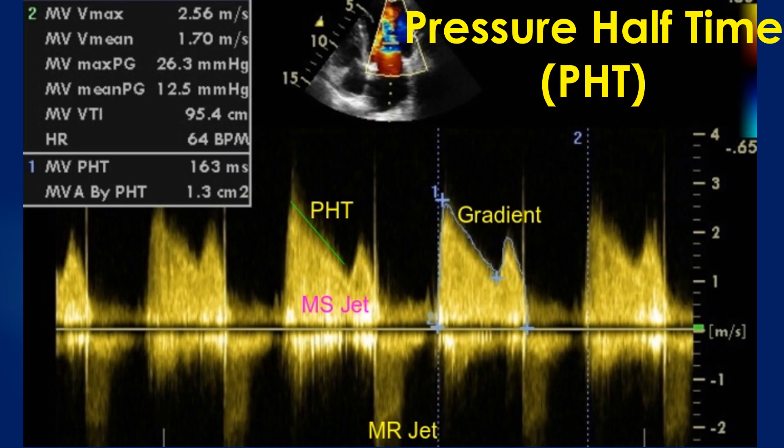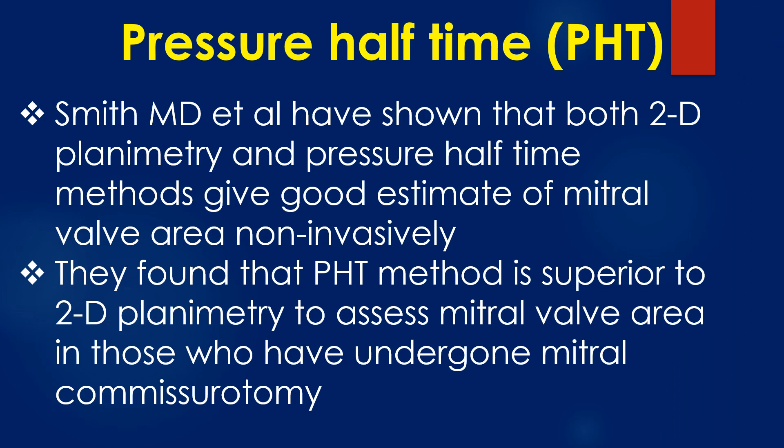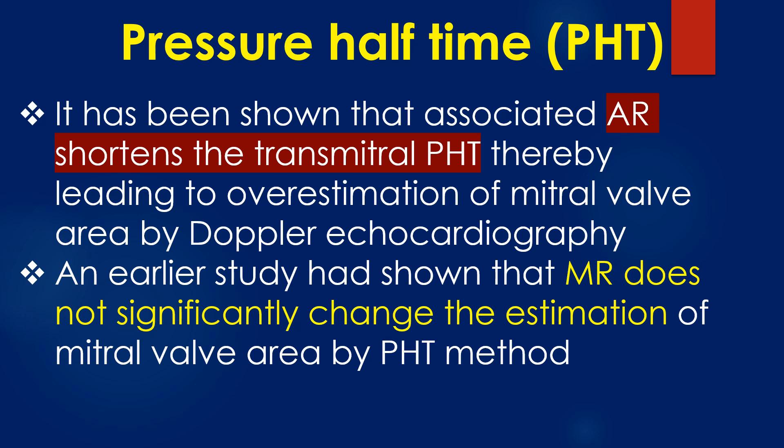In this image, the green cursor measures the pressure half-time of the mitral stenosis jet. In this case, the pressure half-time was 163 ms and the estimated mitral valve area was 1.3 cm². Studies have shown that both 2D planimetry and pressure half-time methods give a good non-invasive estimate of mitral valve area. The pressure half-time method is superior to 2D planimetry for assessing mitral valve area in those who have undergone mitral commissurotomy. Associated aortic regurgitation shortens the transmitral pressure half-time, thereby leading to overestimation of mitral valve area by Doppler echocardiography.